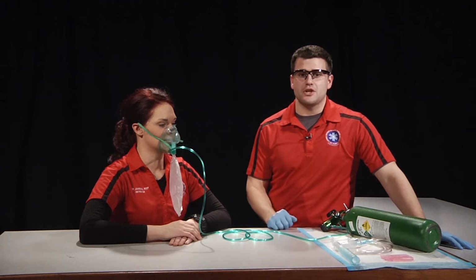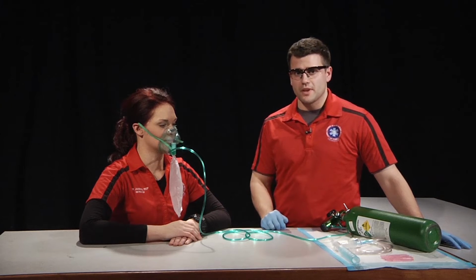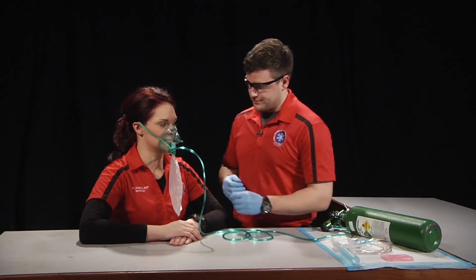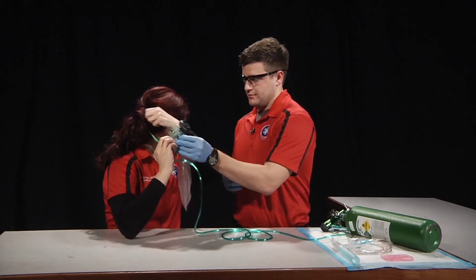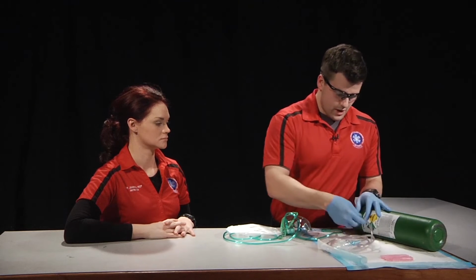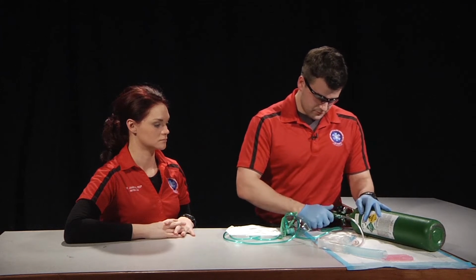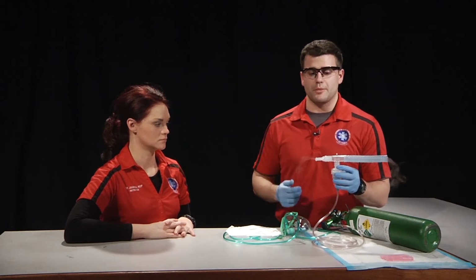Now that we've properly demonstrated how to assemble and administer medication via a nebulizer, we're going to show you how to coach a patient to use the nebulizer. Our first step will be to assist the patient with removing the non-rebreather mask. From here, we'll turn the oxygen bottle off, disconnect our non-rebreather, and connect our nebulizer. Now we're going to coach our patient on how to use the nebulizer.